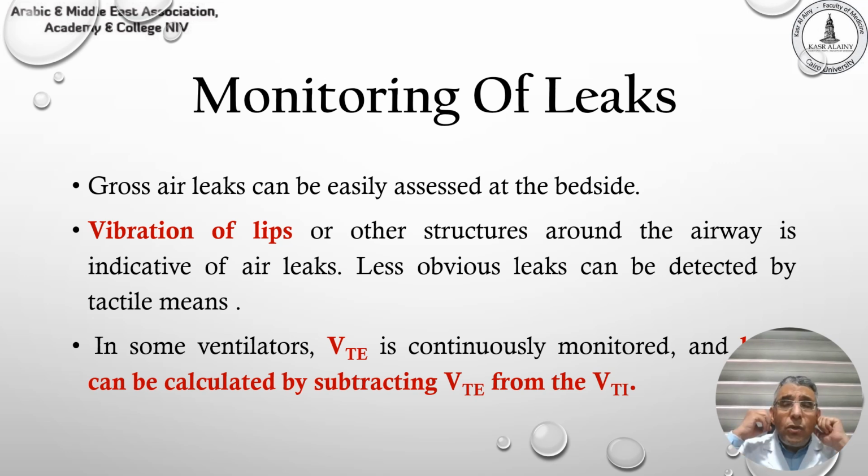By gross leak, you can easily hear it at the bedside. You may put your hand on the mask, and this will show you that there is excessive leak. You may hear a continuous leak from the mask. You may find vibration in the lip or other structures indicative of air leak.